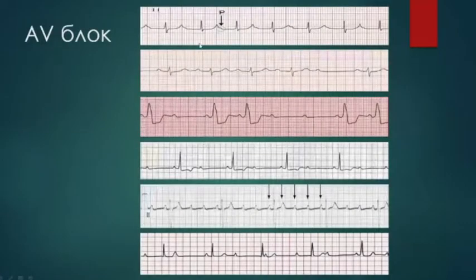This is the first scenario here. So we can take this one, because the beginning of the QRS complex is the end of this square, so 5 small squares, 6, 7, almost 8, rather 280, probably more, right? So we have AV block first degree.